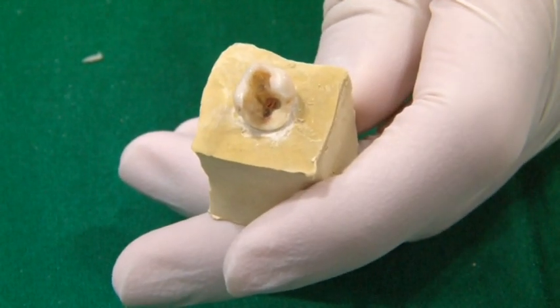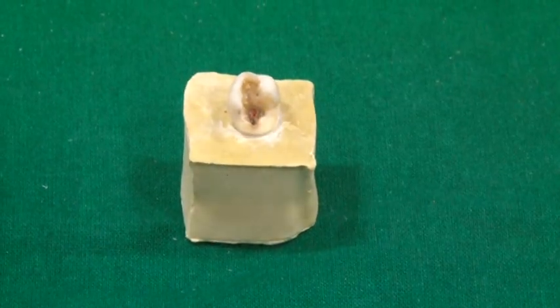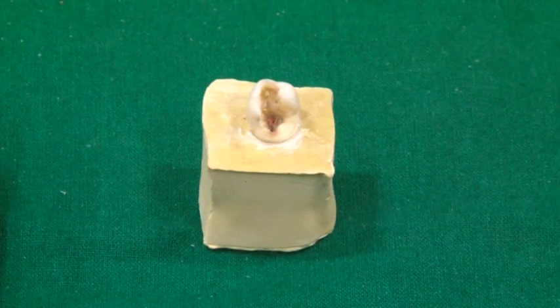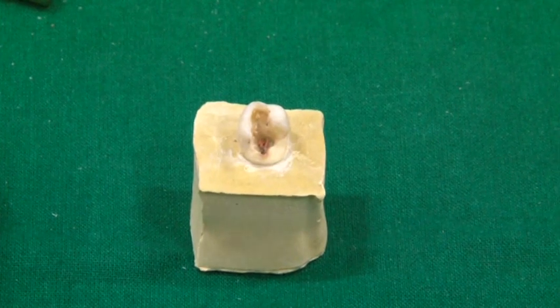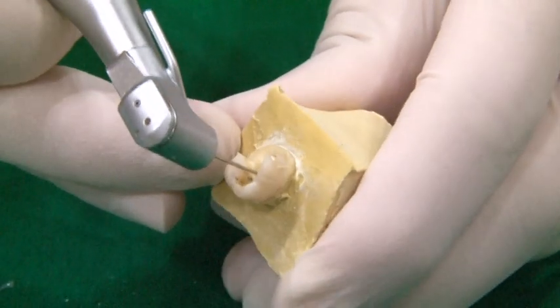This is an endodontically treated lower second molar. As you can see, the buccal and mesial walls are destroyed due to caries, necessitating a post. Since the distal canal is the widest of the two canals present, we will place a post in the distal canal. We start the preparation of the post space using No. 1 Peeso reamer.